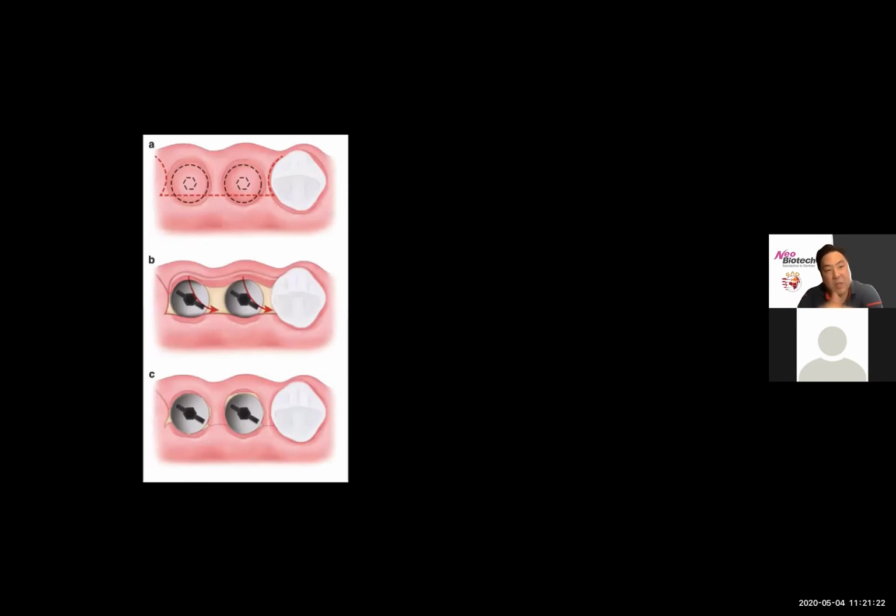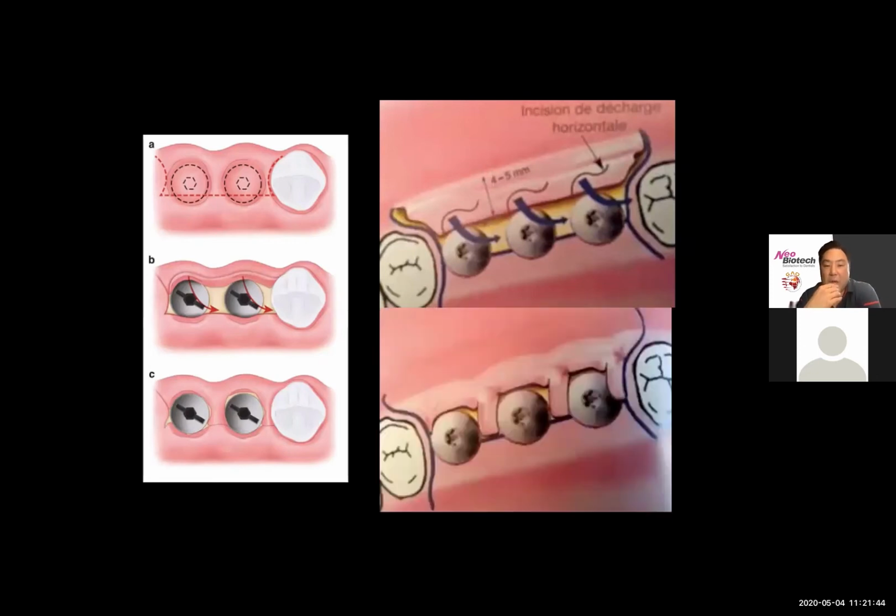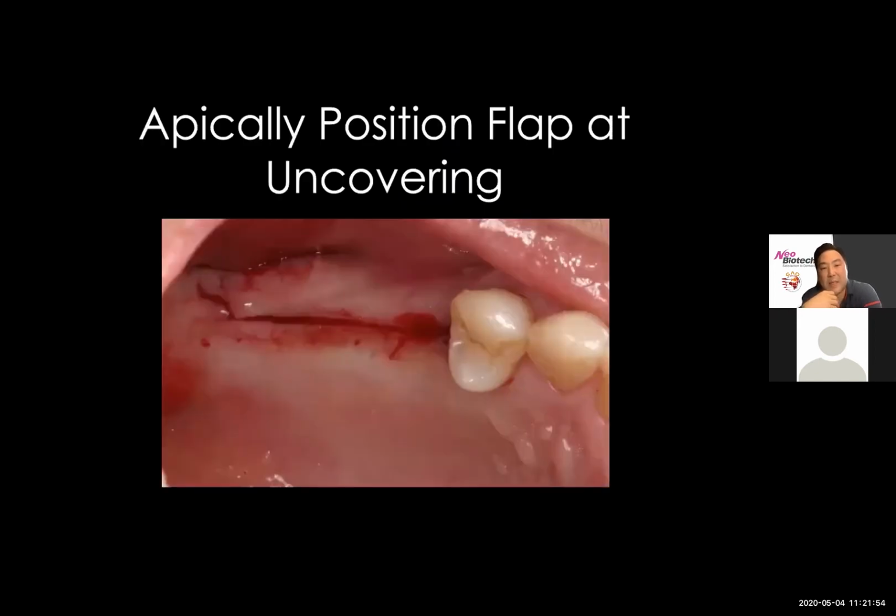From the schematic, as you can see, I lay my incision more to the lingual, and wherever I have the widest band of keratinized tissue, either from the buccal flap or from the palatal, I can incise a small wedge of tissue, not dissecting it, keeping it connected at the base, and swing that tissue over interproximally or between the implants. As you can see from the picture on the top right, I swing over that band of tissue so that it will mimic the look of a papilla placed within the two implants that you see in the pictures. Then we can stabilize that with some sutures.